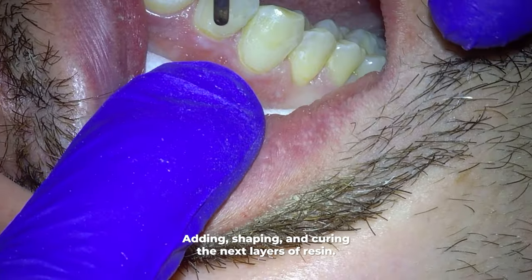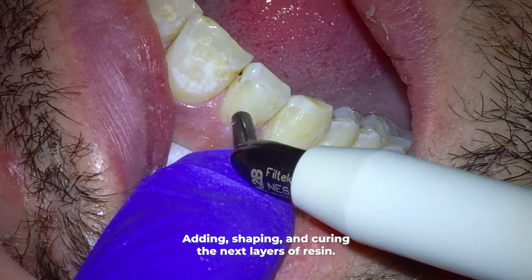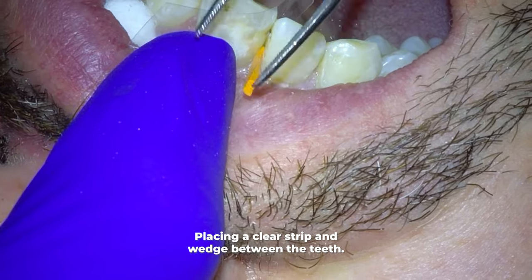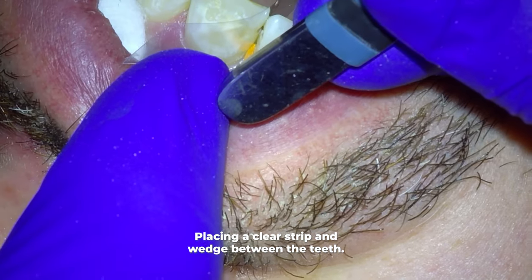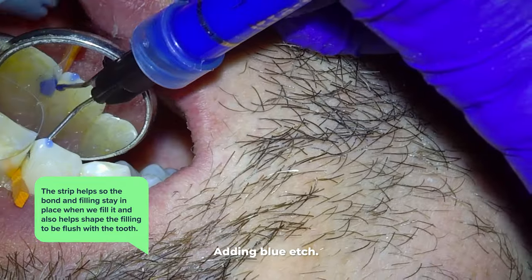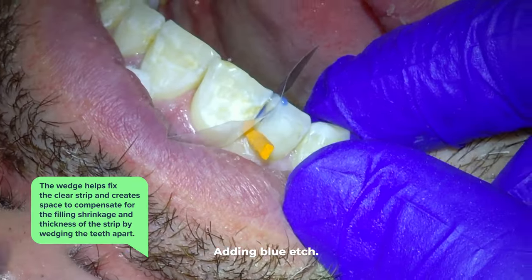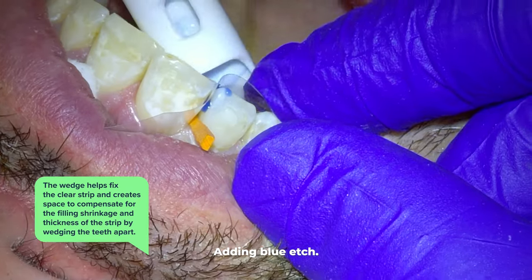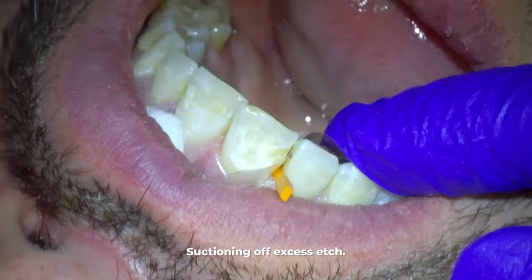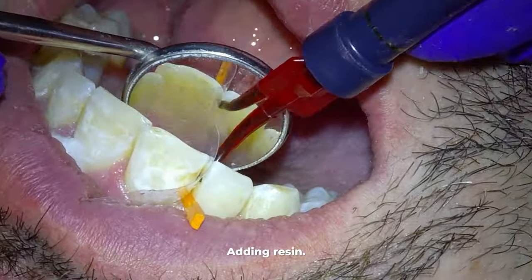After multiple layers that I light cure, the more layers I do the more it starts to look like a whole tooth. Before shaping, refining, and polishing these fillings, we fill in the preps between the teeth as well — mostly the same steps as before, except we place a clear strip and wedge in there. The strip helps keep the bond and filling into the prep only so it doesn't get everywhere, and helps make the transition of the filling to the tooth smooth and flush. The wedge fixes the clear strip into place and also slightly wedges the teeth apart — without it, the shrinkage and the space of that clear strip would possibly leave a gap where food and debris can get caught.